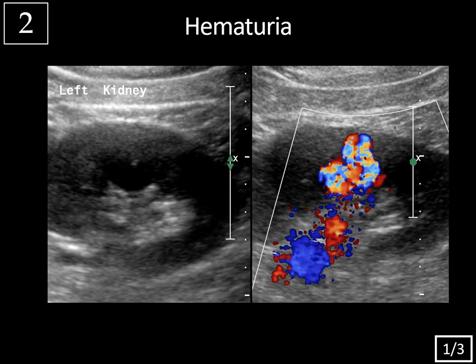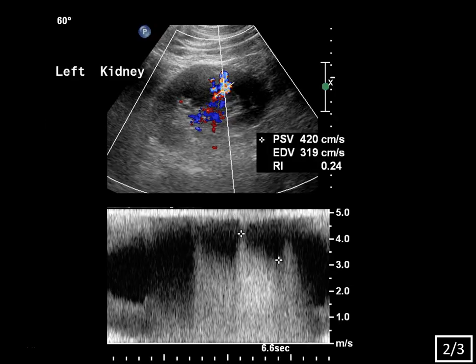When we add spectral Doppler imaging, there's quite a bit of aliasing and a very high velocity, low resistance waveform. The velocity is elevated and diastolic flow is very high compared to normal renal arterial flow. If we were evaluating a draining vein here, we'd see arterial pulsation consistent with AV shunting.